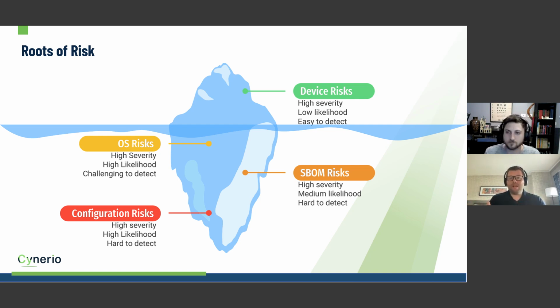An infusion pump or an IV pump is intended to deliver medicine in some consistent way. But if you look at the components of that device, it's everything from the outer plastic shell and the buttons you're pushing to the silicon chips that are actually processing that data, with probably 10 to 15 layers of components that came from different manufacturers in between. So whenever we're looking at something like that, it's not just an IV pump. It's an incredibly complex piece of machinery that has a lot of different libraries, a lot of different components that are incredibly vulnerable. Anything to add to that, Asher? No, that's great. Okay, cool.